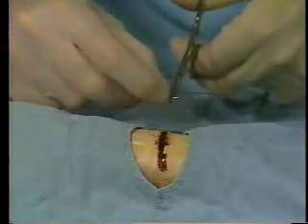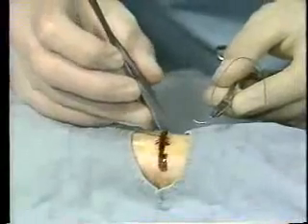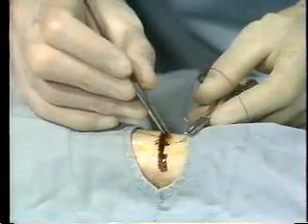Attach the suture needle to the needle holder and place it in the dominant hand. Hold the tissue forceps in the other hand. Begin suturing in the middle of the laceration so that the edges will be evenly matched. Beginning this way also prevents puckering.